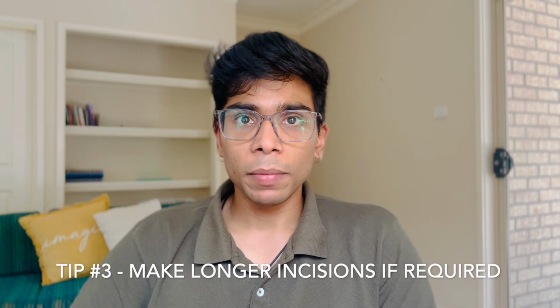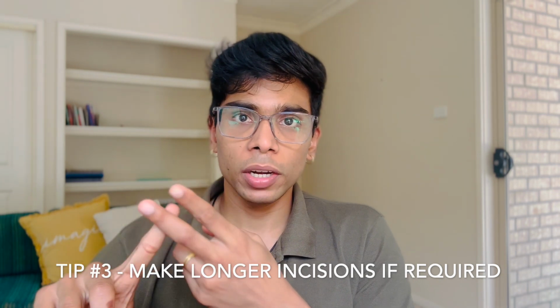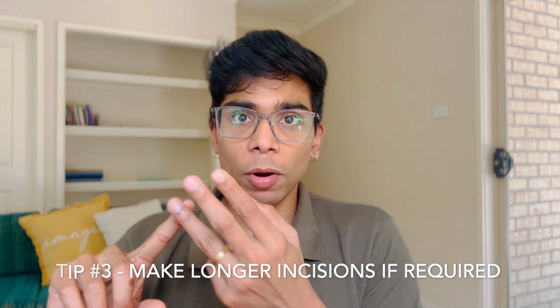The next tip is that sometimes you're unable to identify the anatomy, for whatever reason, whether the anatomy is distorted, whether the patient is obese, or whether there's a significant amount of edema or a hematoma. When identification of the anatomy becomes difficult, you might need to extend your incision, sometimes 5, 6 centimeters, and open up the wound a little bit to actually determine the anatomy. Remember, this procedure requires steady hands and very clear judgment. Practice and familiarity with the equipment is essential. I know a lot of emergency physicians who've practiced this for a long time but have gone through their entire careers without having done even one.